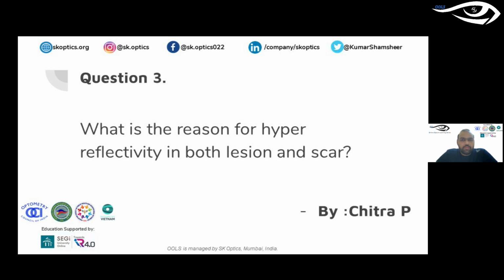But hyperreflectivity as such basically represents that there is something wrong, because there is a certain amount of reflectivity that has to be maintained. This is because you actually measure the time delay and the difference, right, when you measure the images in the OCT instrument.